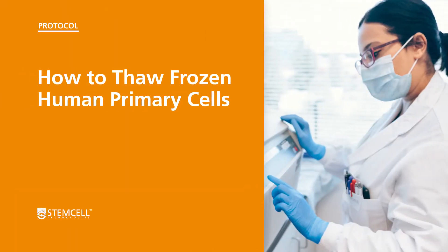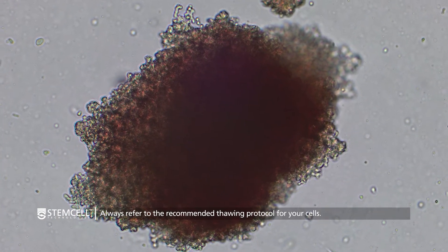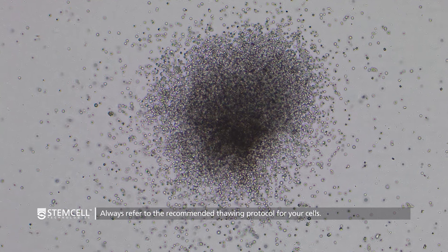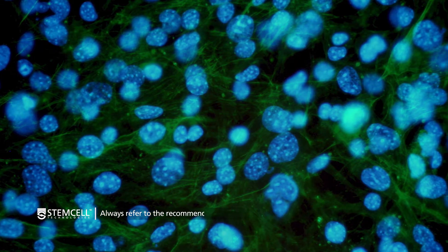In this video, we will demonstrate how to thaw frozen primary cells. As thawing protocols for specific cell types may vary, always refer to the recommended protocol received with your cells.